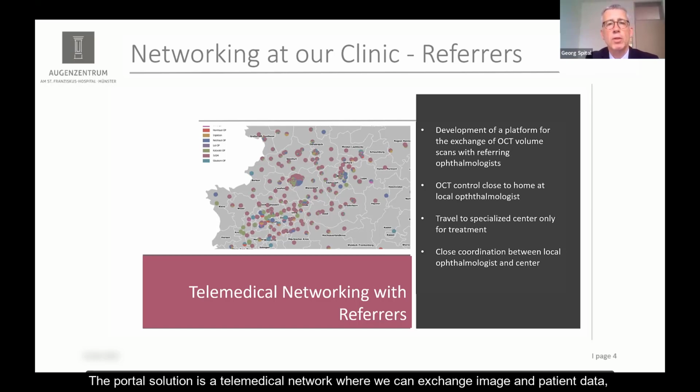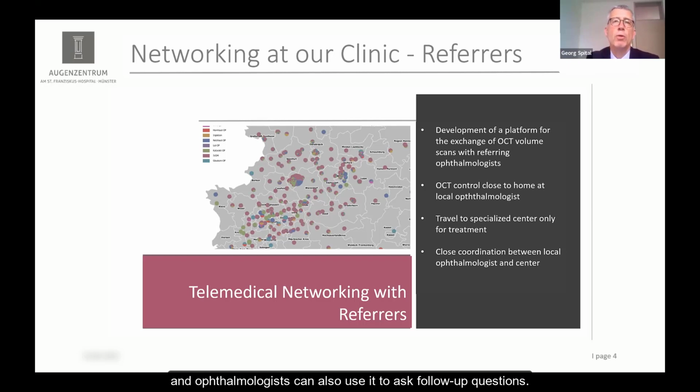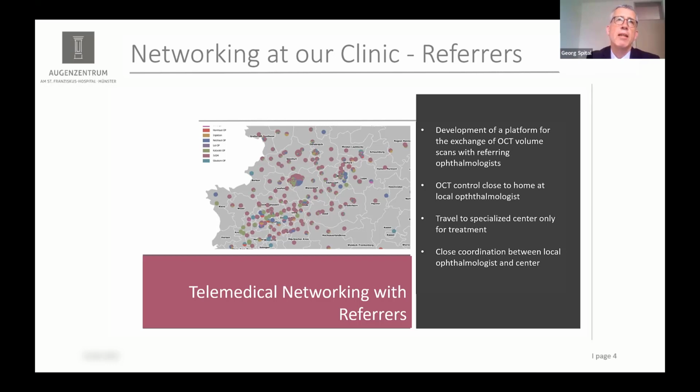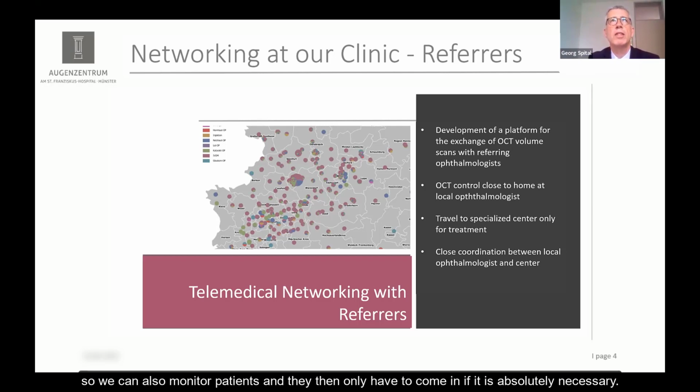The portal solution is a telemedical network where we can exchange image and patient data, and ophthalmologists can also use it to ask follow-up questions. Monitoring can be carried out after the treatment, for example, so that the OCT is taken closer to home but we still have all the OCT images, so we can also monitor patients and they then only have to come in if it is absolutely necessary.